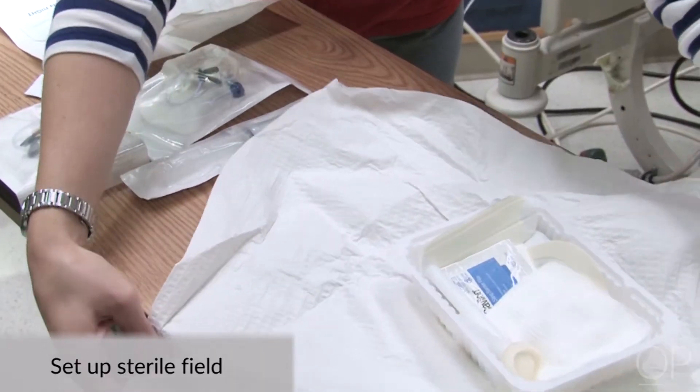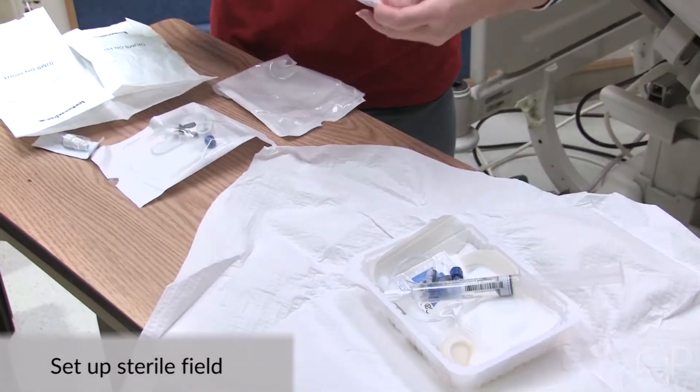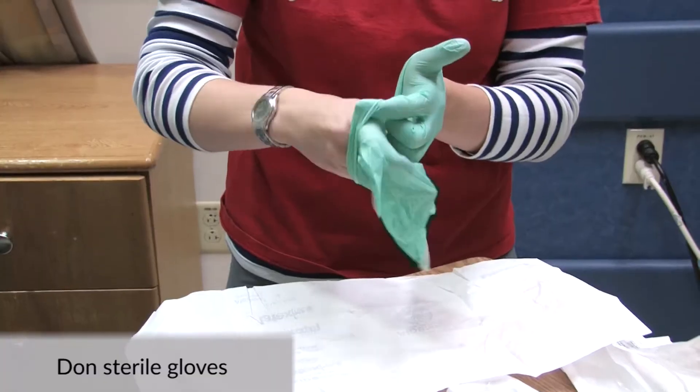Open your sterile field. Open your sterile non-coring needle set, 10 ml sterile normal saline syringe, and needleless connector onto the sterile field. Don sterile gloves.